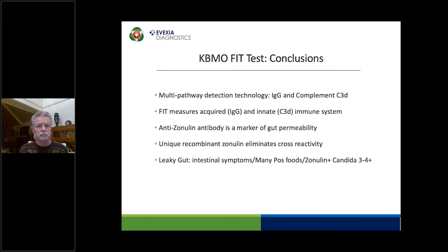Okay. And lastly, just another comment about the coffee. I was 4+ for coffee, but nothing for wheat. So that was that earlier question about the coffee. Offhand, I can't tell you where exactly that's coming from. But if I had the test results, I knew medical history, I knew supplements and medications, I could start to flesh that out. So that's a bit of a quandary right now.